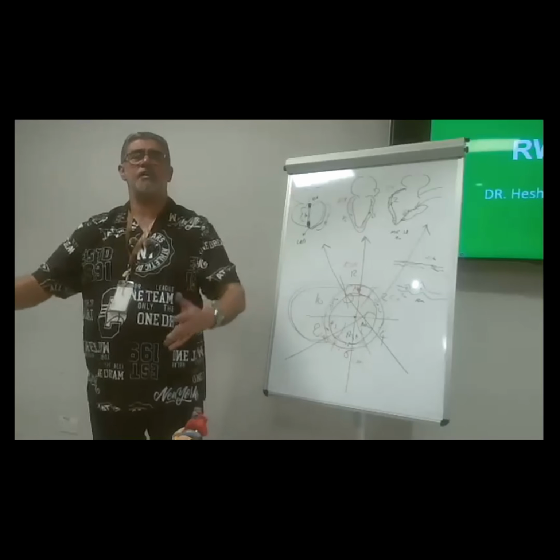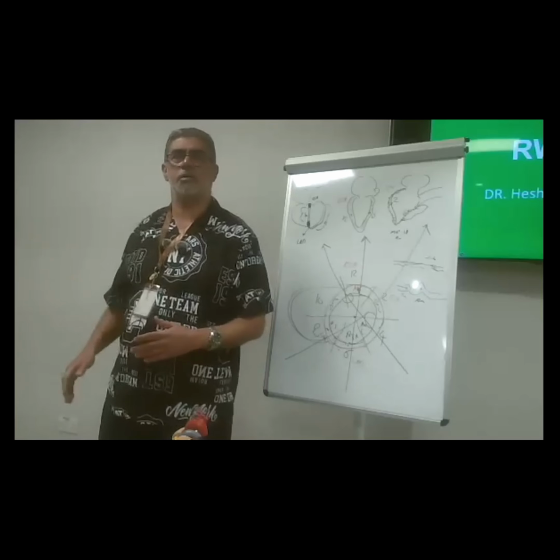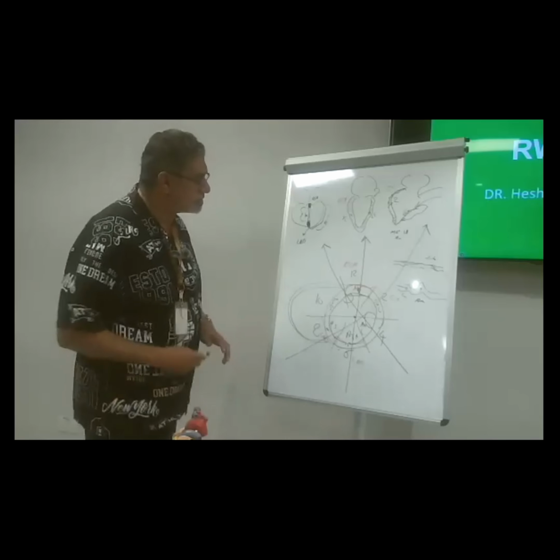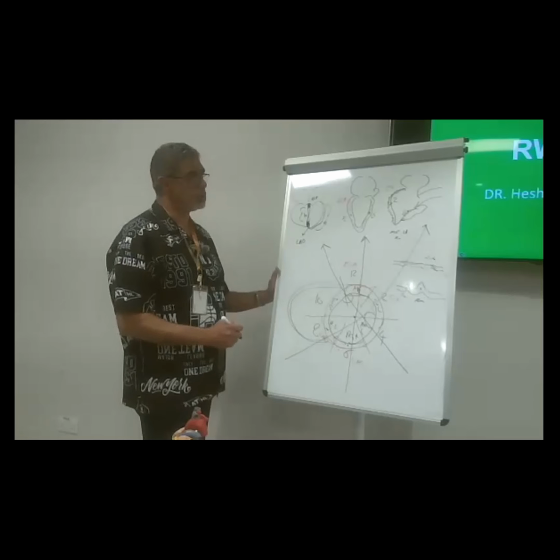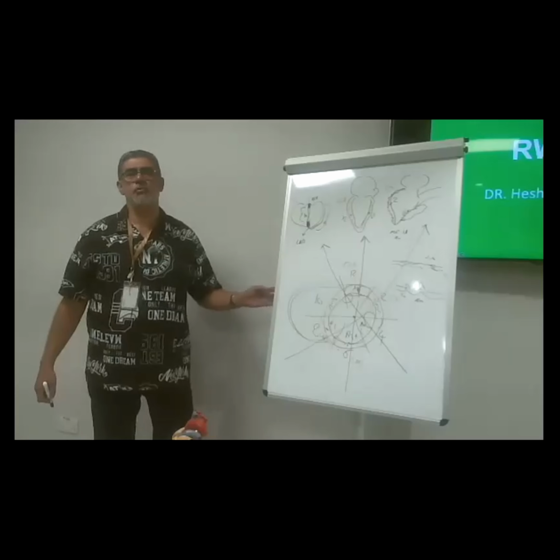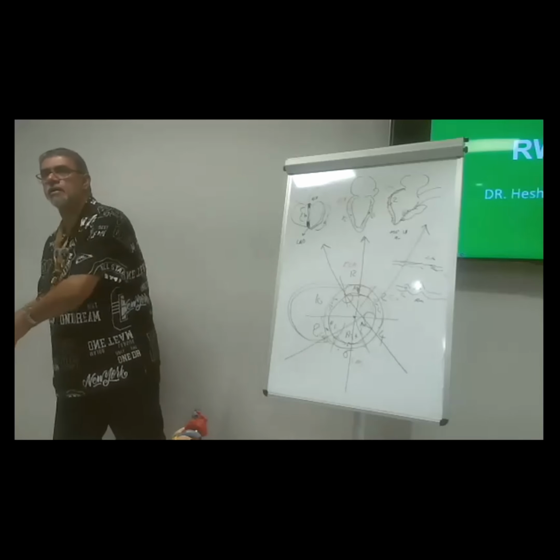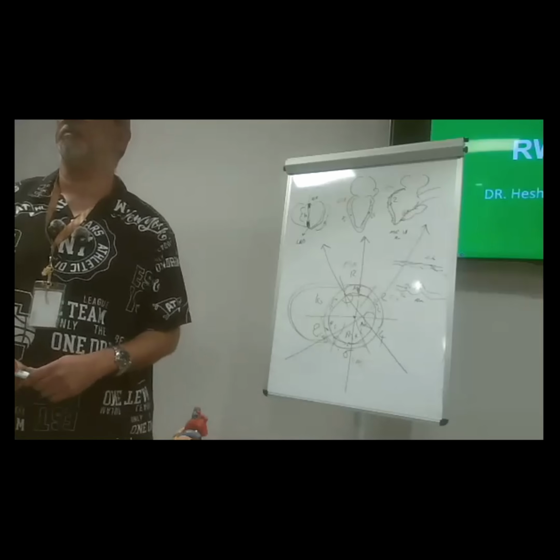We're still in mitral valve replacement. Again, the same scenario. Hemodynamics are borderline, not responding to filling or inotropes. This time you look at the TEE and you find this area hypokinetic. You want to confirm. It's hypokinetic. Why? Any explanation? We are in the mitral area. We didn't go to the right coronary at all. Air. Excellent, Dr. Fatma. Air.